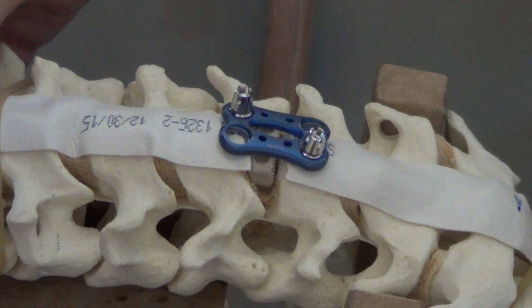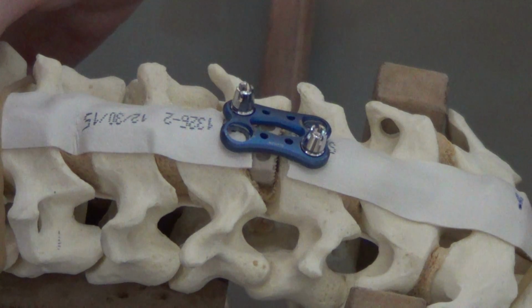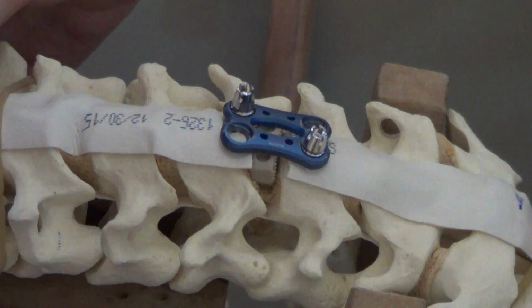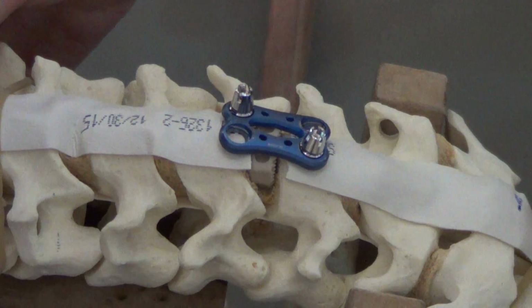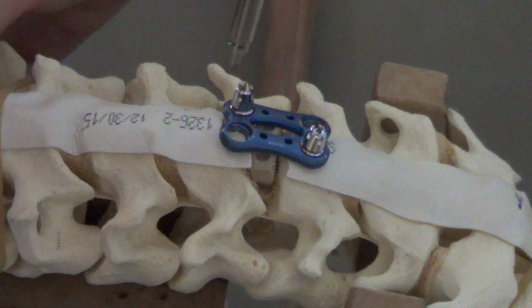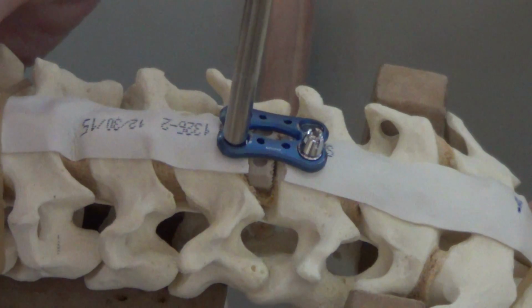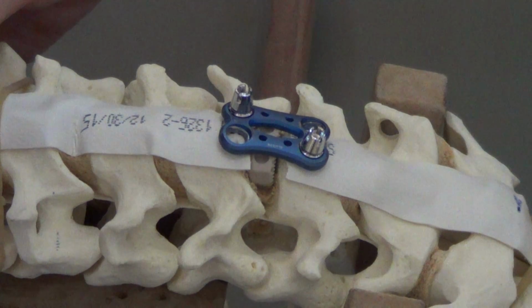Nowadays we have these screws which are all locking screws. If it is a locking screw, it is not necessary for the screws to have a bicortical purchase. So unicortical purchase is good enough. Looking at the sizes, usually in a male Asian, we use about 16 millimeter screw. So initially what you do, you use an awl to make a hole first. Then after that, you straight away, I don't think you have to pin, self-tapping.